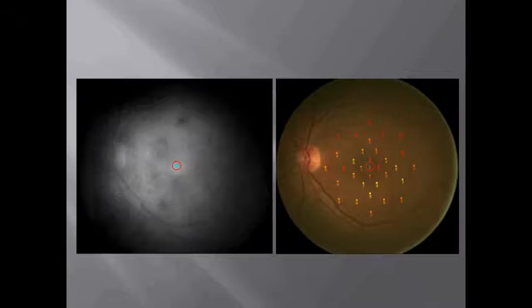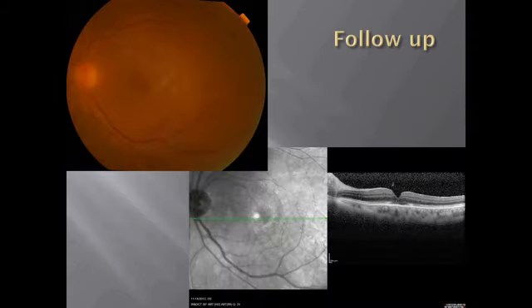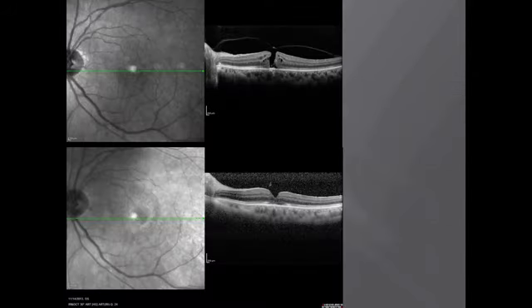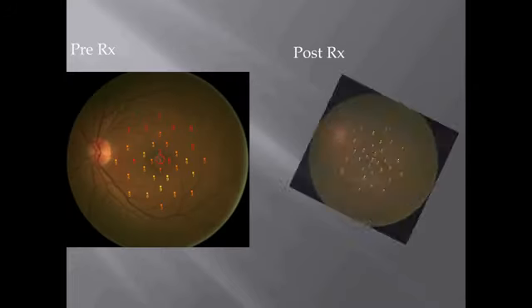This is another case of a macular hole which you see on a pre-surgical one, and this is the post-surgery follow-up that we see on a closed hole, and now when you do it, this is an early, smaller hole, and it does much better. You see the reds turning into greens much more effectively in such a situation.